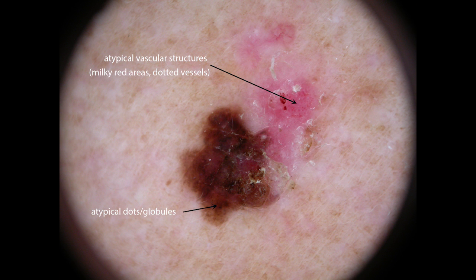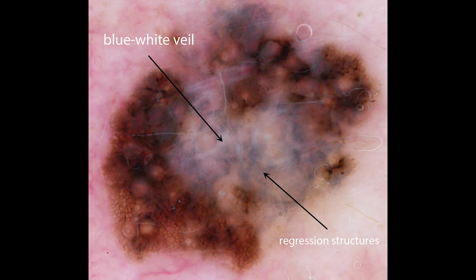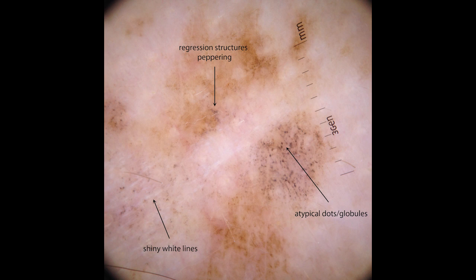This dermoscopic image of a melanoma shows atypical vascular structures such as milky red areas, dotted vessels, and on the periphery, there are some atypical dots and globules. In this melanoma, there are regression structures with a blue-white veil. This melanoma on sun-damaged skin shows regression structures with peppering, and atypical dots and globules, along with some shiny white lines.